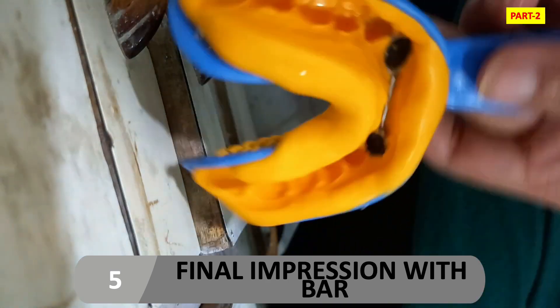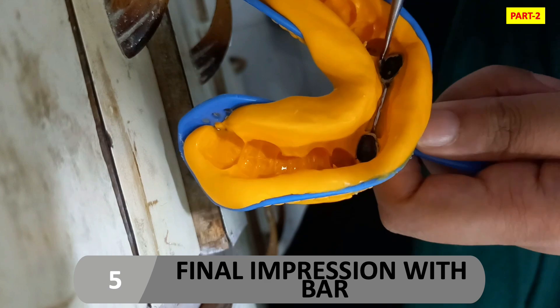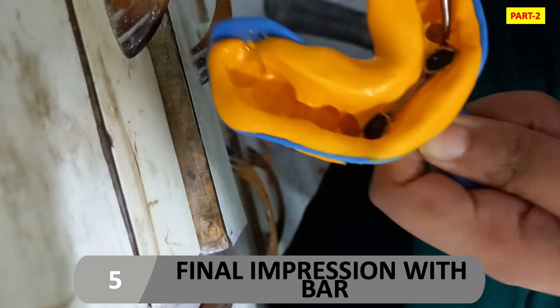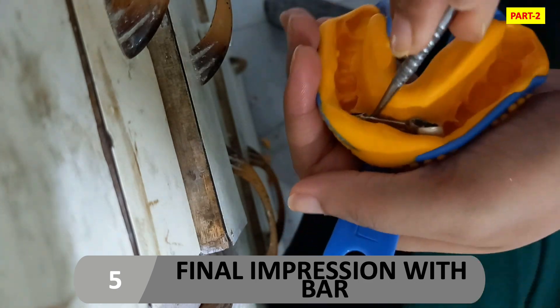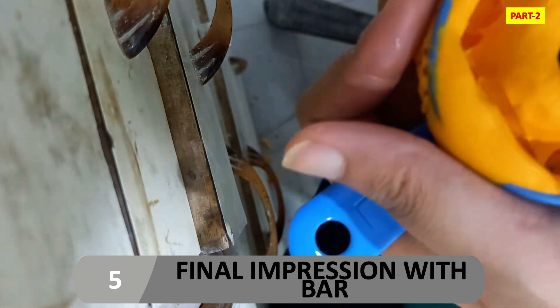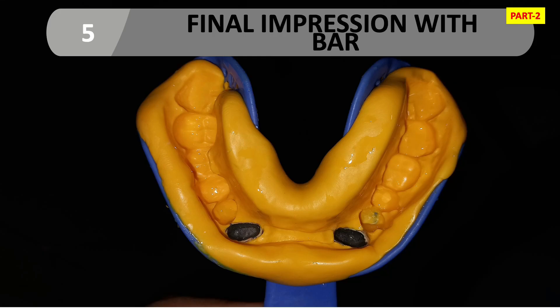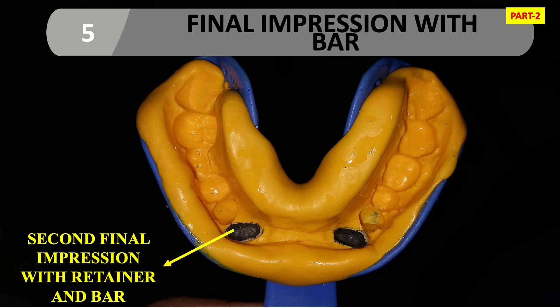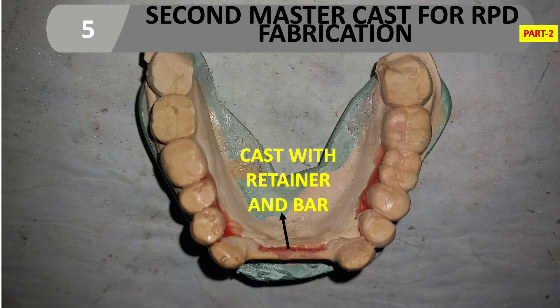The fifth step is the final impression with bar. If making an impression with the bar, after taking the impression you remove the bar and then pour the impression. If taking an impression without the bar — meaning after cementation — you pour the impression right after taking it. We remove the retainer with bar and pour the cast. This is the second final impression taken with silicone, giving us the second master cast for RPD fabrication.